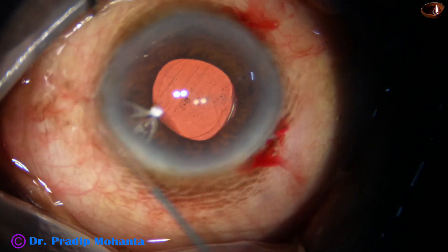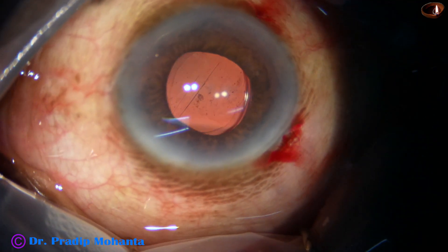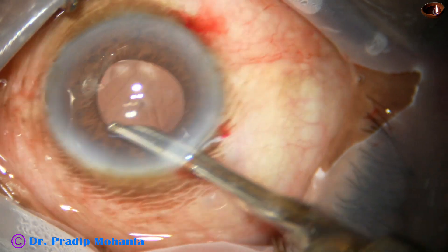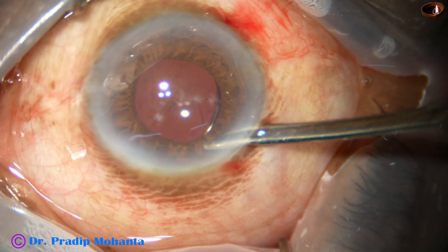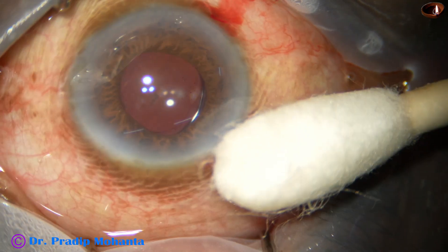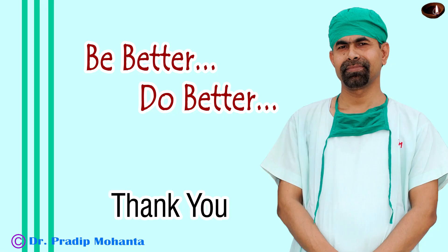A bit of moxifloxacin is applied. The side port is closed by corneal stromal hydration. The side port at 7 o'clock has been used only once and does not require any hydration. This is the final lavage and formation of the anterior chamber. Integrity of the wounds is checked by a cotton-tipped applicator. No leakage anywhere from any wound. A few drops of moxifloxacin are applied over the ocular surface and the case is concluded.